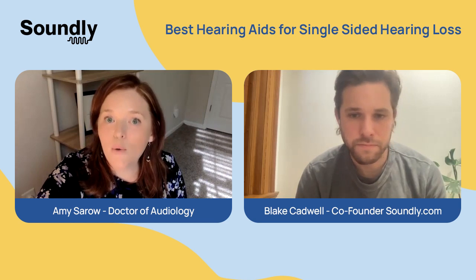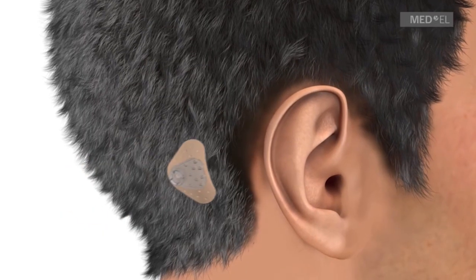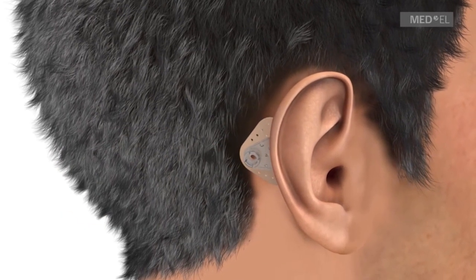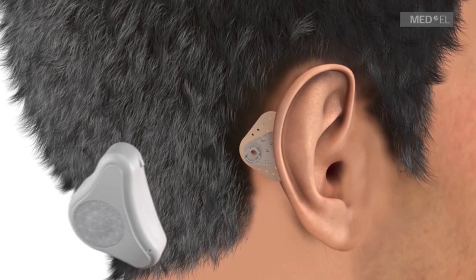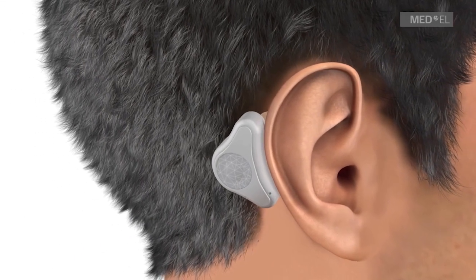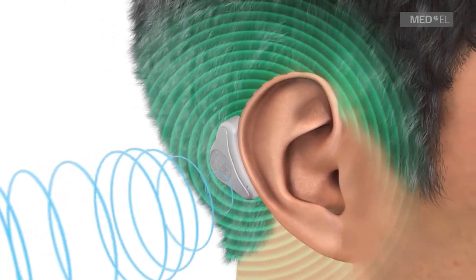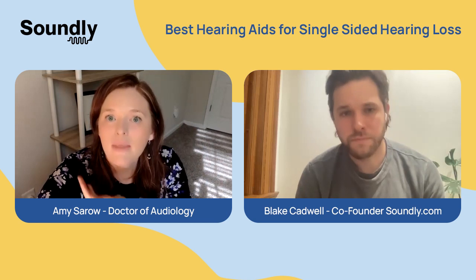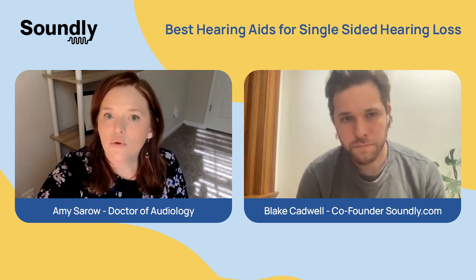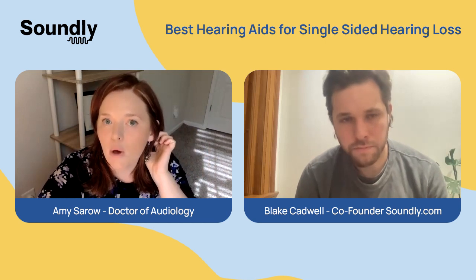Another option is called a BAHA, which is a bone anchored hearing aid. This does involve surgery, and there's a piece called an abutment that is placed on the poorer ear. Then there's a piece that attaches to that — like a hearing aid — that sends sound through the bones of your skull, and that will be received by your better ear. It's the same idea as a CROS, but it's surgically integrated into the bone of your skull.